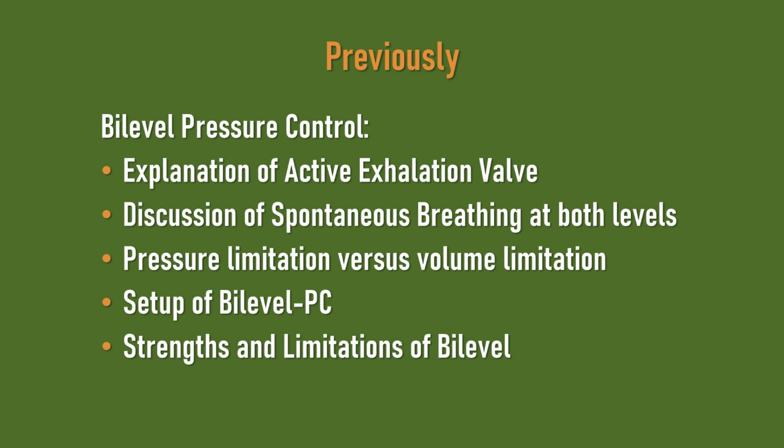I explained the difference between pressure limitation and volume limitation, how to set up bilevel pressure control, and the strengths and limitations of bilevel. The major strength is you can use this mode of ventilation for pretty much any patient in the ICU at any time.